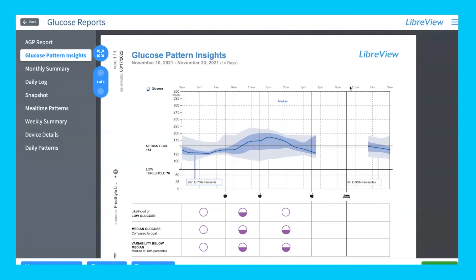You can see the times at the top — it's important that your handheld monitor has the correct time, so keep daylight savings in mind. On your handheld monitor or mobile app, you can also mark when you're eating your meals. For example, I had breakfast around 8 a.m., lunch exactly at noon, and dinner around 6 p.m. You can see around lunchtime there's a small spike in sugar levels that then comes down. This is helpful for your doctor to see how your meals correlate with your blood glucose levels.